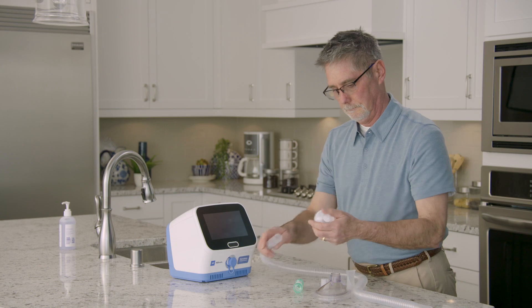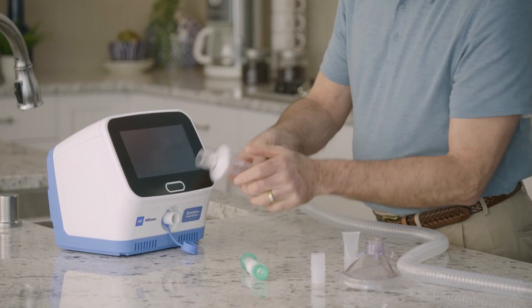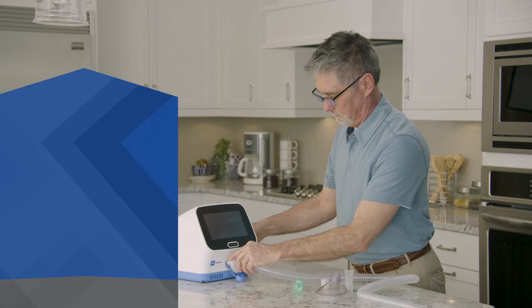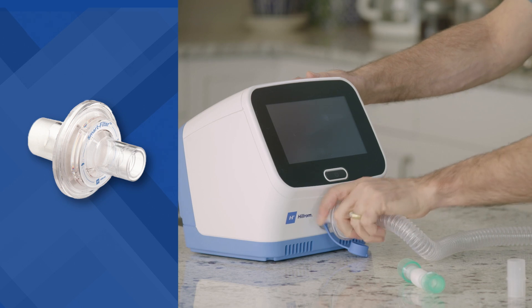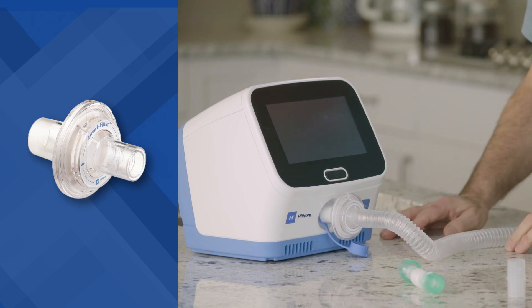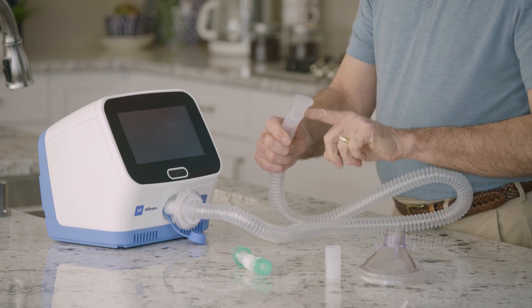To assemble the circuit, attach the smart filter to one end of the breathing hose. To connect the circuit to the controller unit, align the larger end of the smart filter with the therapy port on the control unit and gently turn the smart filter to secure it. Make sure the frosted part of the smart filter covers the therapy port entirely.